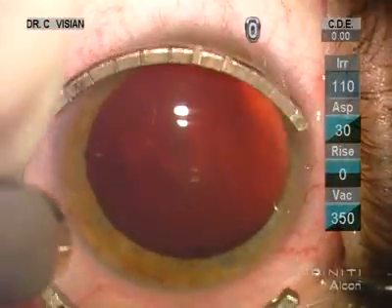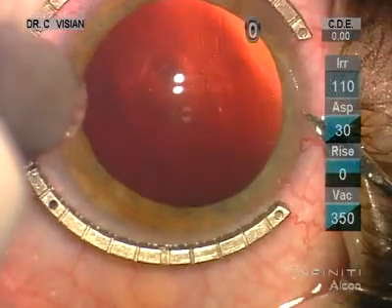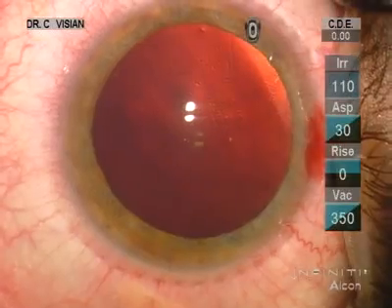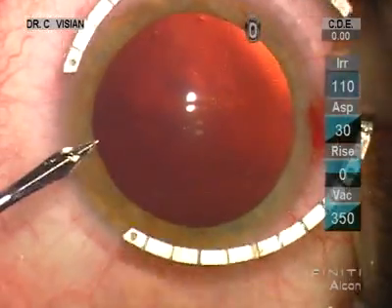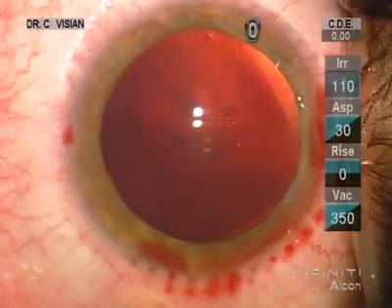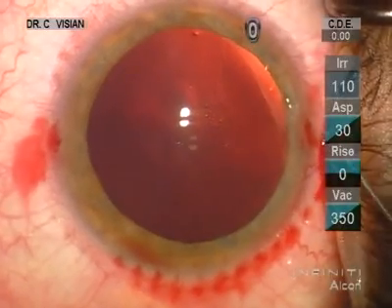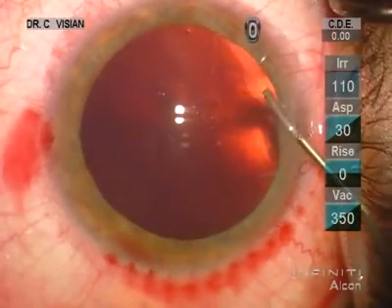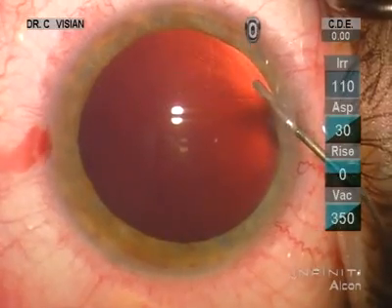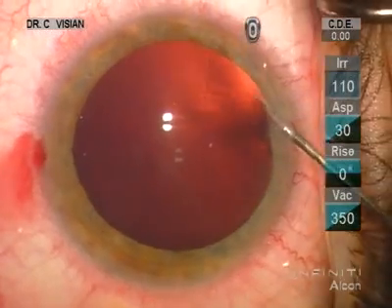Look in the center of the white light for me please. We'll make our two paracentesis incisions — I like to angle them towards the distal direction of the footplates, the way they'll go, dropping into the cornea. A little 1% lidocaine — may feel a little stinging numbing drop there. And she's nicely dilated, which is good.